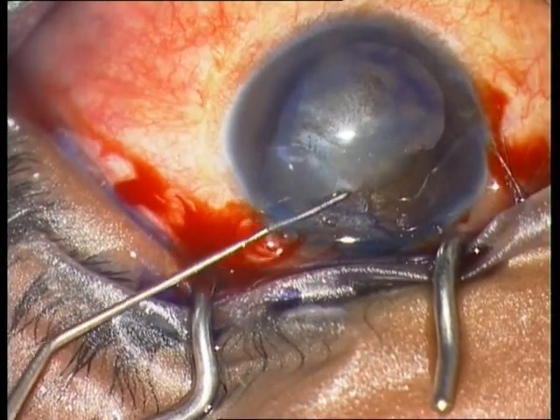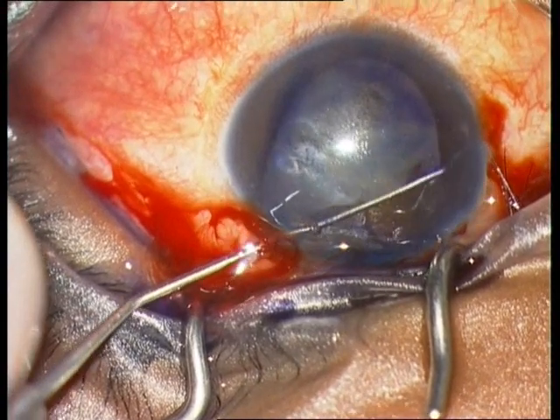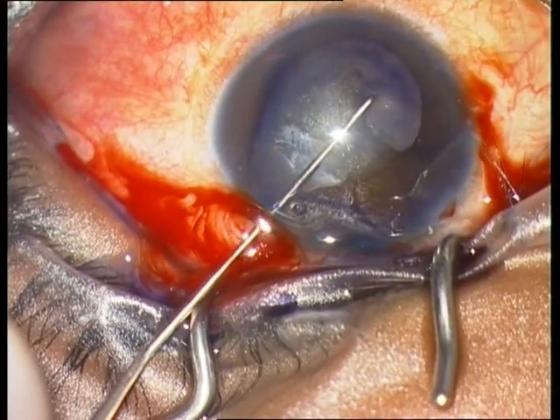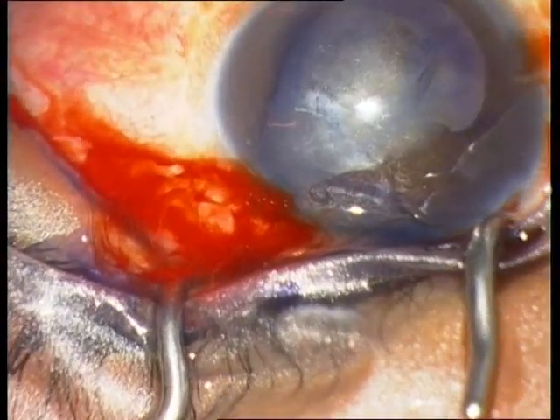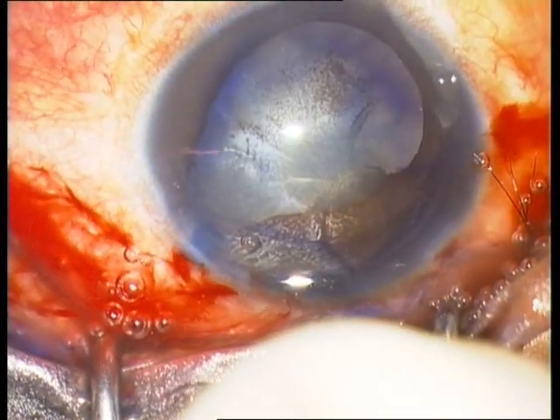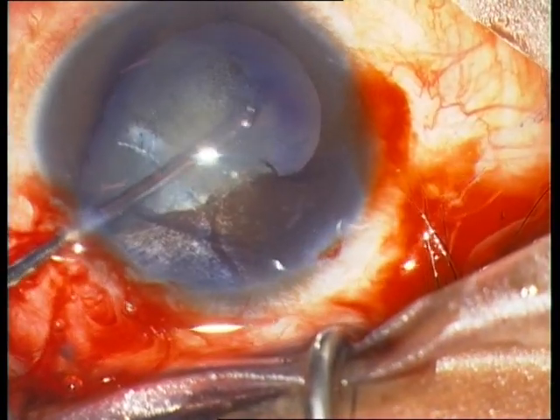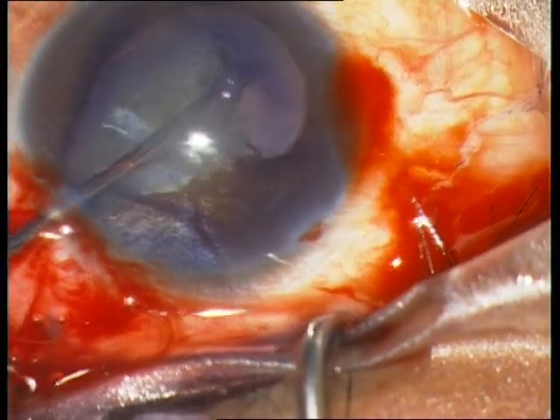Using a push-pull instrument, I try to remove the anterior synechia, which is more difficult than expected. I realize now that a membrane is covering the anterior capsule, and I am not completely sure if I am dealing with a membrane or the anterior capsule. You can see a small flap at 10 o'clock. I am therefore using a membrane spatula to be on the safe side, trying to remove this membranous structure.